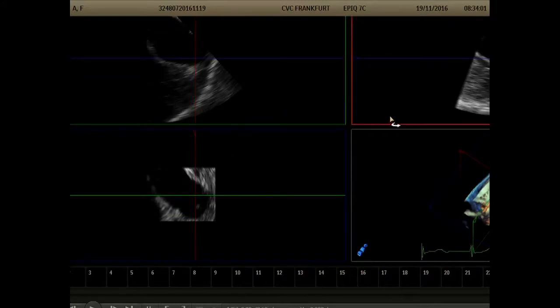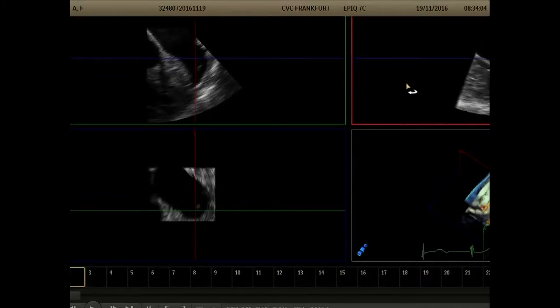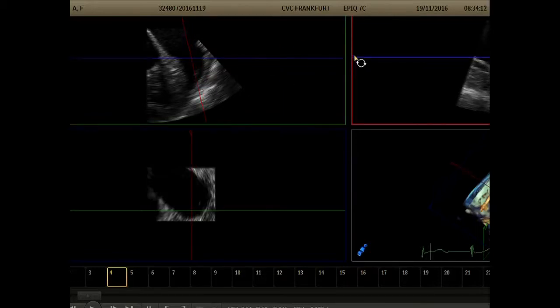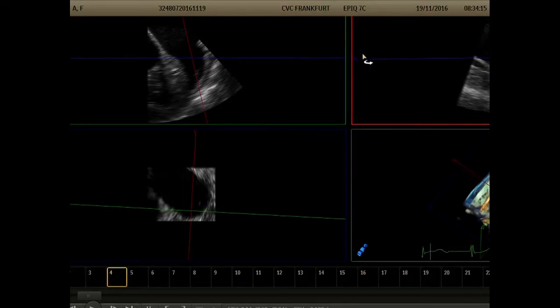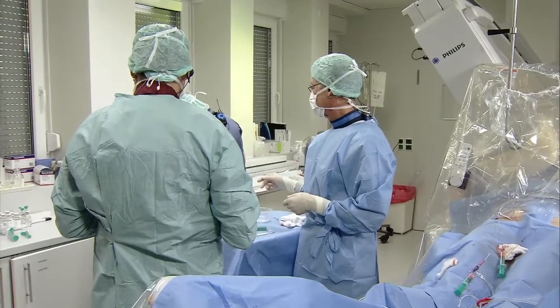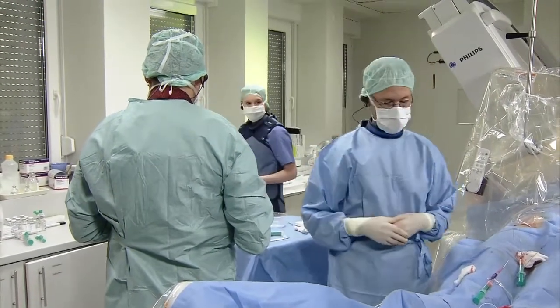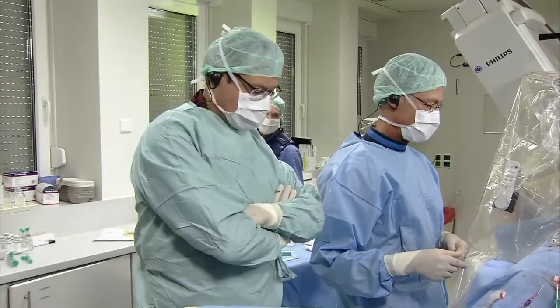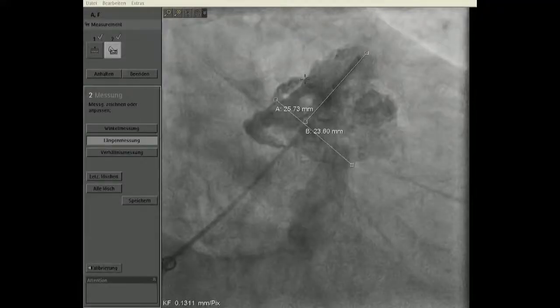Kevin, it's still okay, isn't it? Yeah, I think it would be fine for either device. I think with the amulet it may be a little more difficult, but I think you could certainly do it with the amulet. Which size, Kevin? I think it's doable with either, but I think the Lambre would be if you measure the anterior lobe to choose the actual umbrella and your cover. I think that would be how I'd select the device there. So we've got a choice of 3 devices now. So let's start with the amulet, and we can change later if we want. So Kevin, if you try this with an amulet, which size?